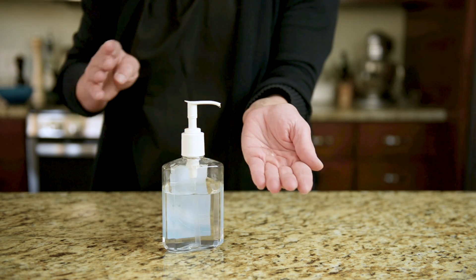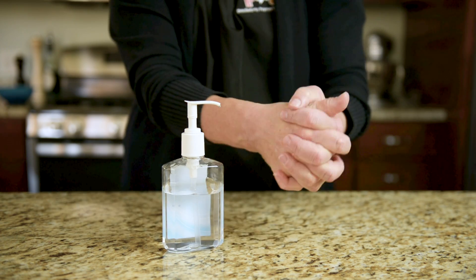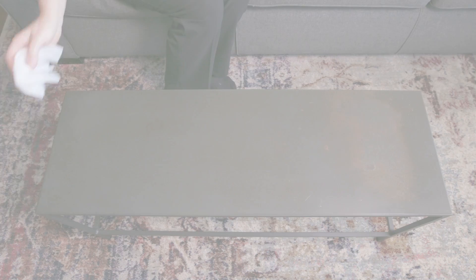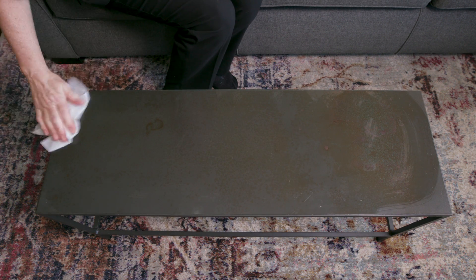Start by cleaning your hands with soap and water or alcohol-based hand gel. Clean your work surface with soap and water or a disinfecting wipe.